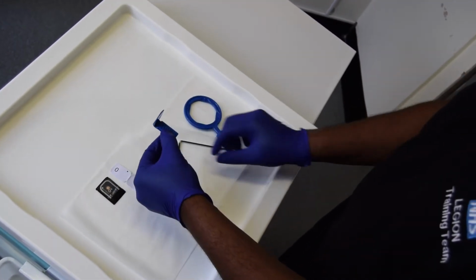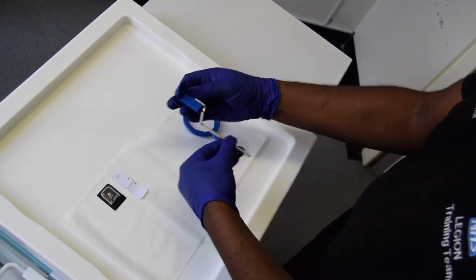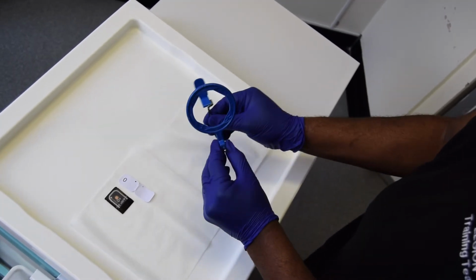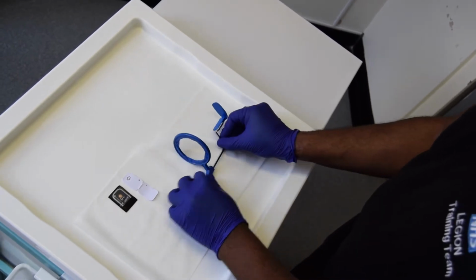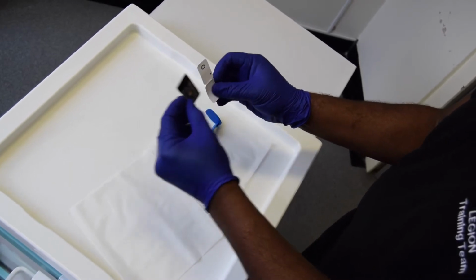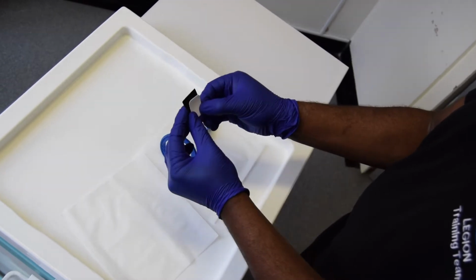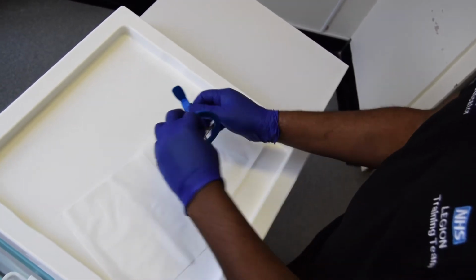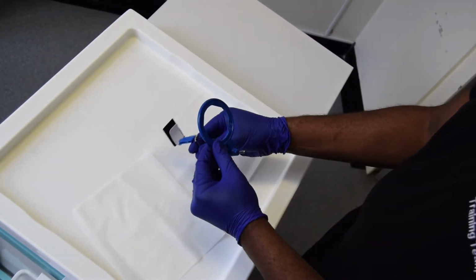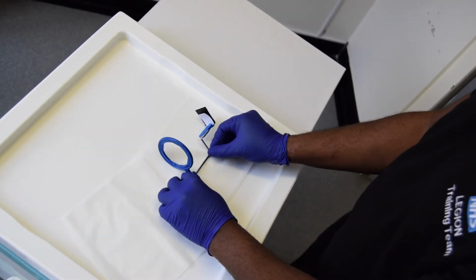To assemble the anterior periapical holders, the aiming indicator must be attached to the side of the holder, then the ring attached to the aiming indicator. The holder should be visualized through the ring, then placing the image receptor so that the dot matches the dot on the card. This is then turned around and placed on the holder so that the blank side is facing the ray. If you look again through the hole, you can see that the image receptor is in the correct place.